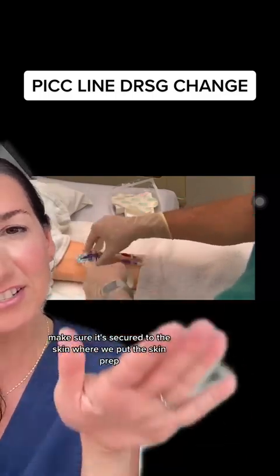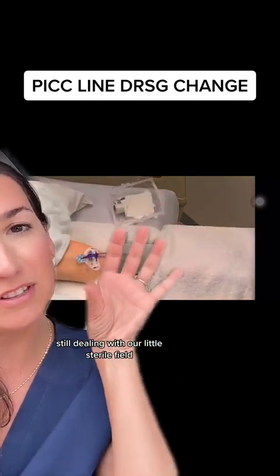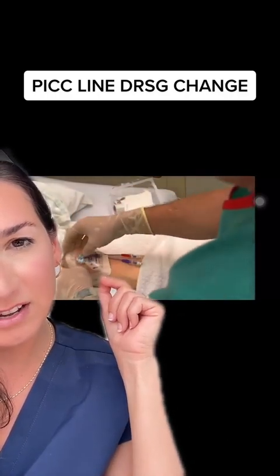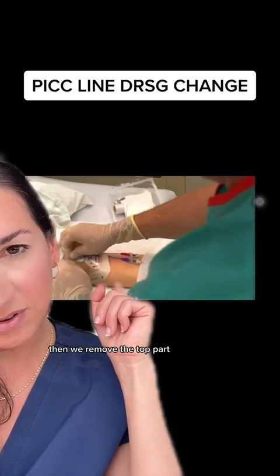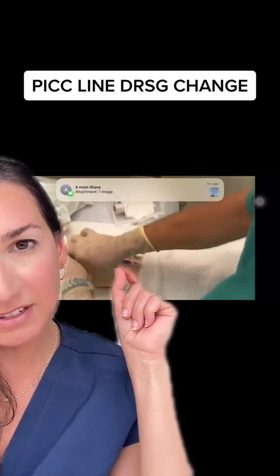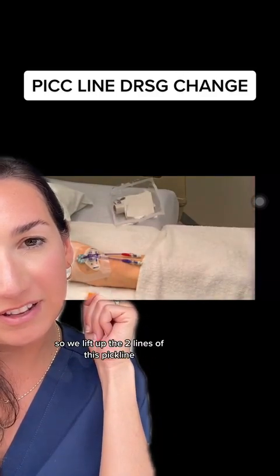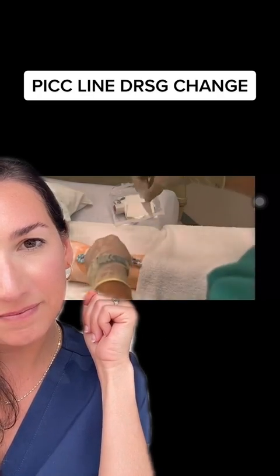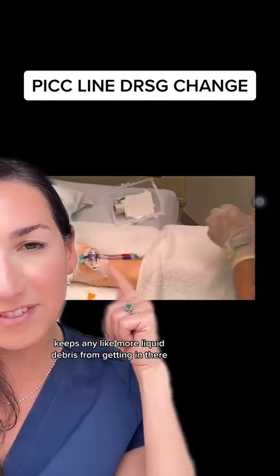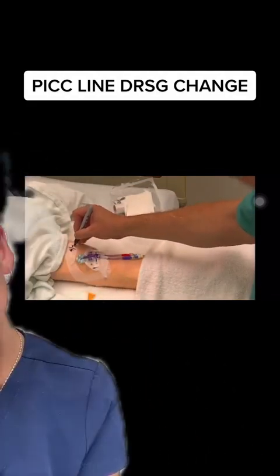Remove the sticky backing on the stat lock and make sure it's secured to the skin where you applied the skin prep — still in sterile gloves, still maintaining your sterile field. Now cover it with the dressing, which comes in two parts. Apply the first part, then remove the top paper backing. Use the second piece to secure the bottom, lifting the two PICC line lumens and placing it right underneath to keep everything secure and prevent debris from getting in. Finally, date it and put your initials — and that's it.